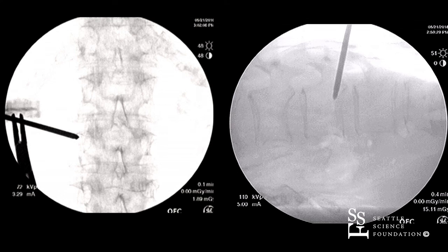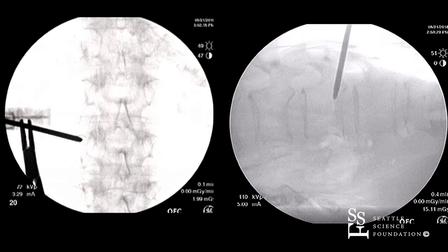I sharpen that end plate at L2. We have the end plate sharpened on the lateral, and now we're trying to attempt that with the AP.